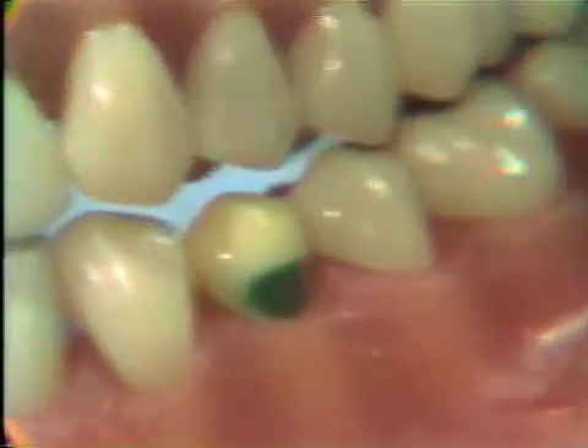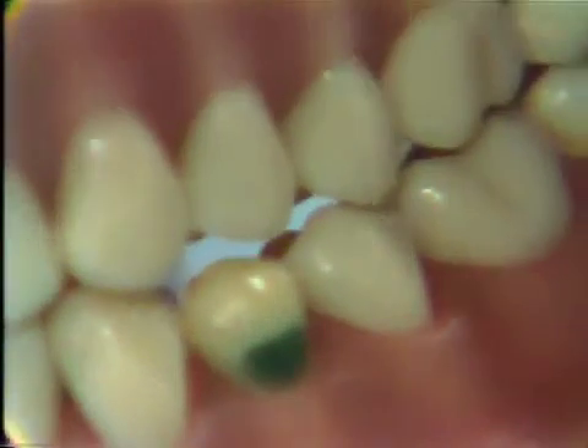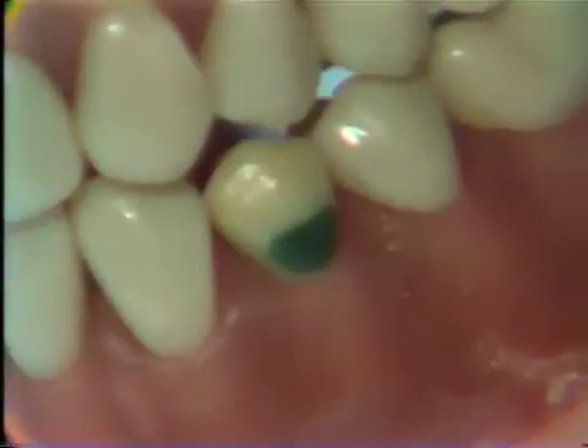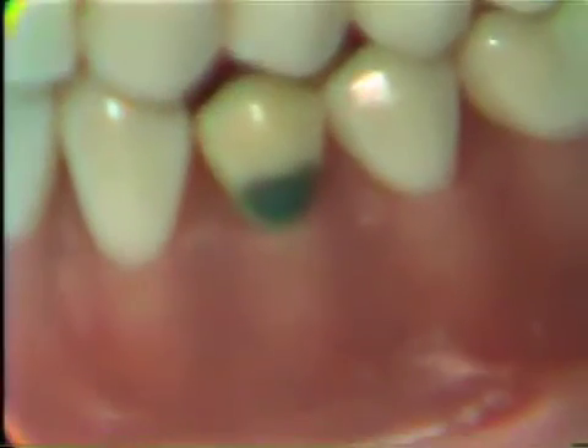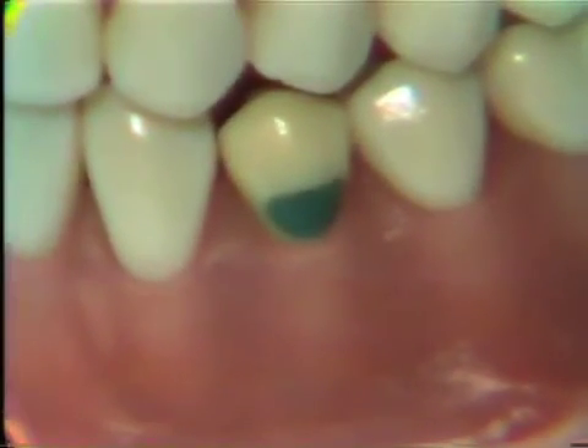When you're satisfied that the contour is acceptable and the wax is smooth and polished, begin with cold water and cotton, and then you should have the restoration — the wax — checked by the instructor.